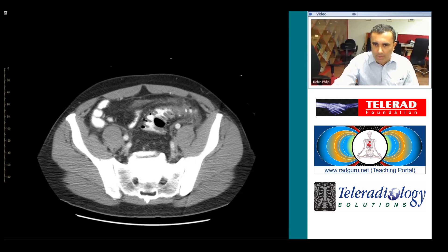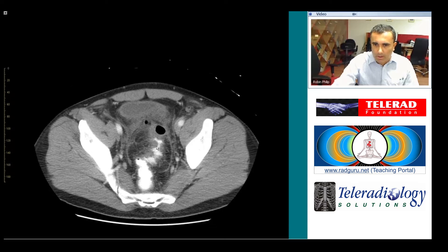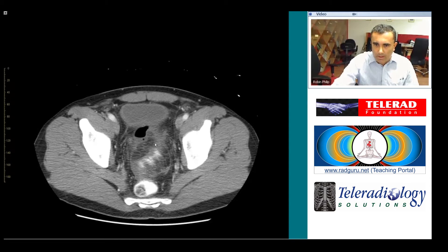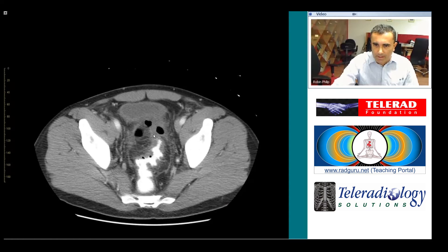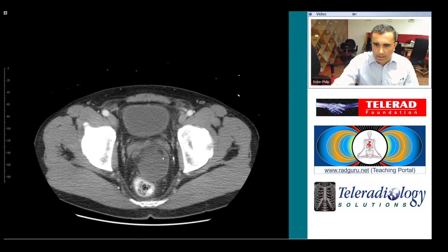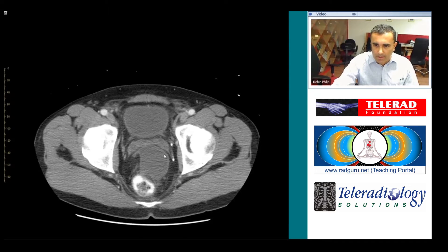As we progress up the colon, we find this extra-luminal air-fluid collection, which is an abscess interposed between the sigmoid colon and the urinary bladder. There is a second rim-enhancing fluid collection posteriorly between the seminal vesicles and the rectum.